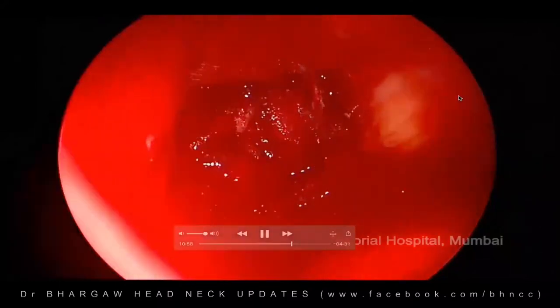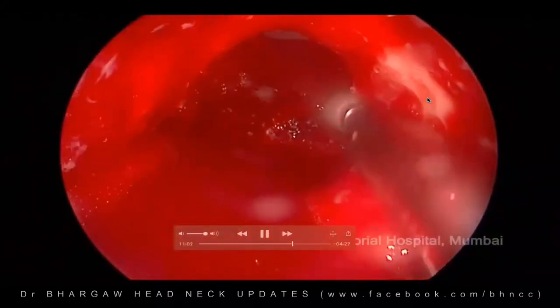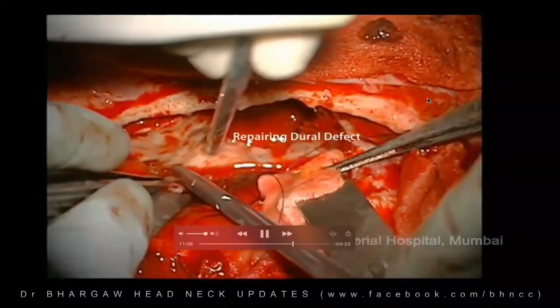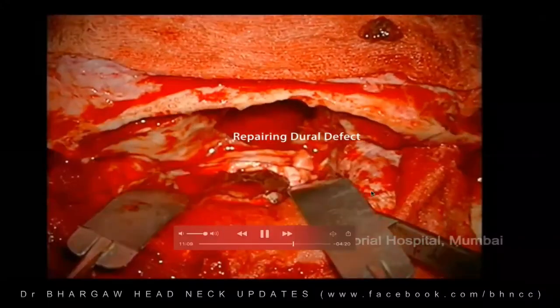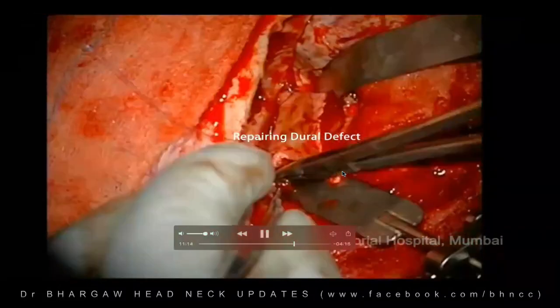There you go. So now we're just drilling the ledge of the bone all along, and now the dura is being repaired with the fascia, the tensor fascia lata. That is the first layer to achieve the seal.